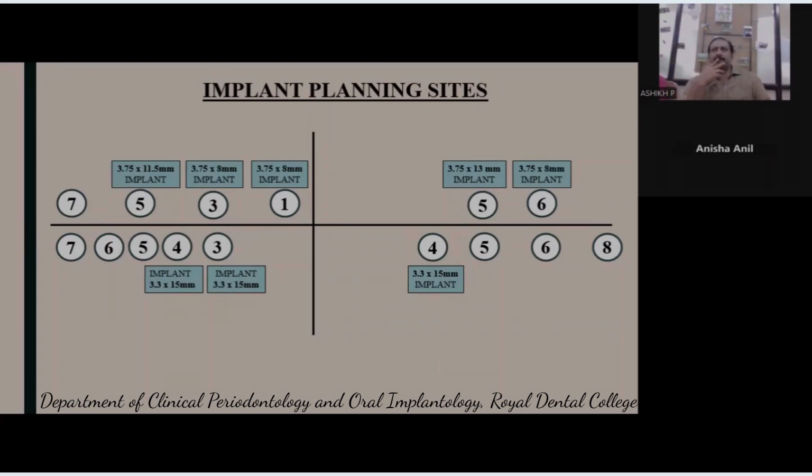So in that condition, you've reasonably compensated with the diameter, we can see. Not that you're having all perfect implants. So considering the majority of these implants as shorter ones, the last one which you are going to place should have maximum size. And what kind of prosthesis will you go for with this?